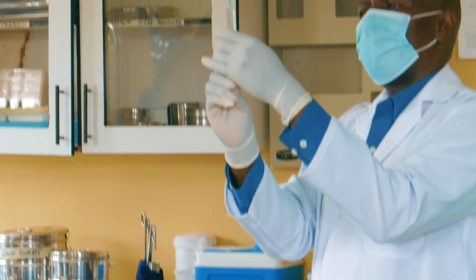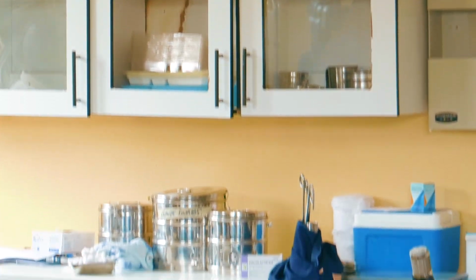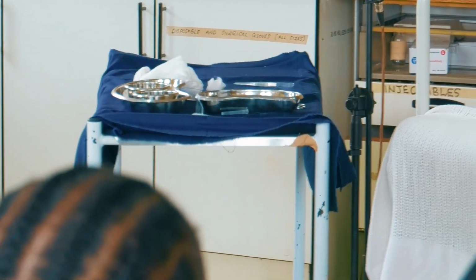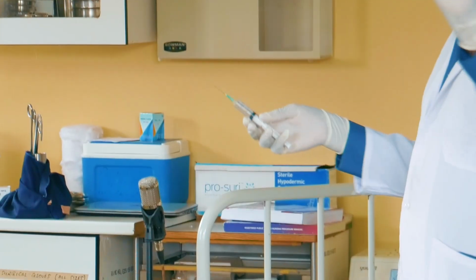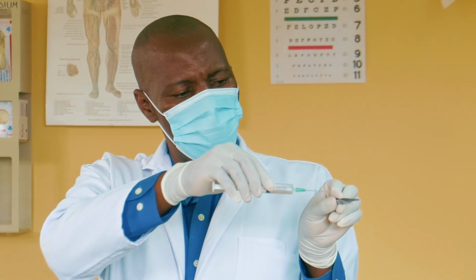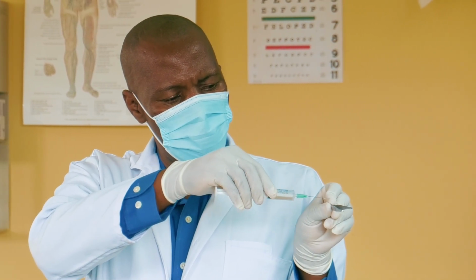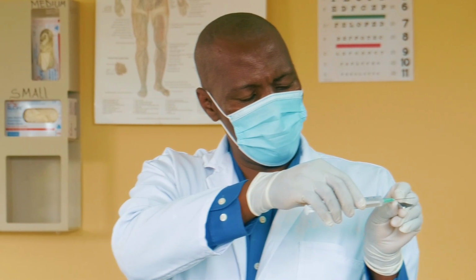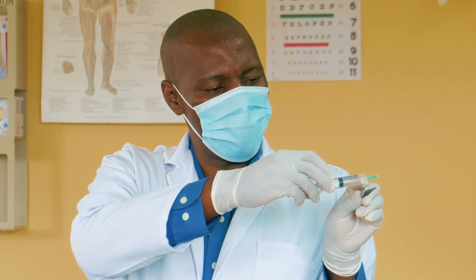Yes. So when you're doing this, I don't know if you'll be able to see, these are the wound edges. Okay, imagine this is the wound here, right? So what I'm going to do is inject in these wound edges, or start from up where there is no wound, push the needle. When I push the needle in, I'll withdraw, right?